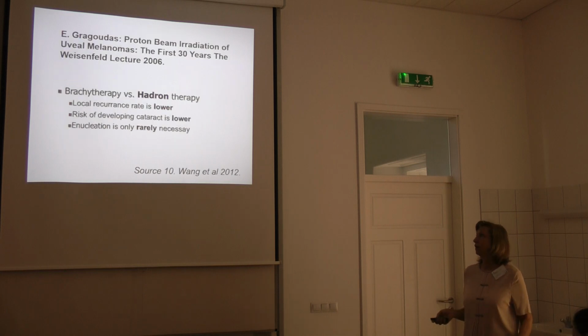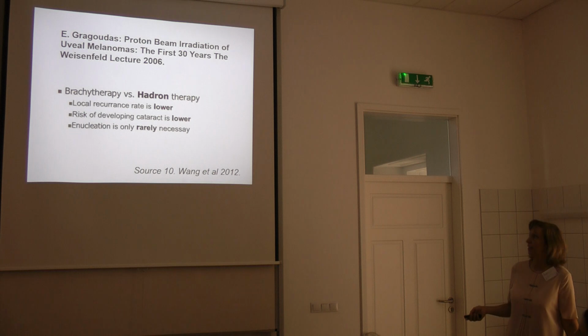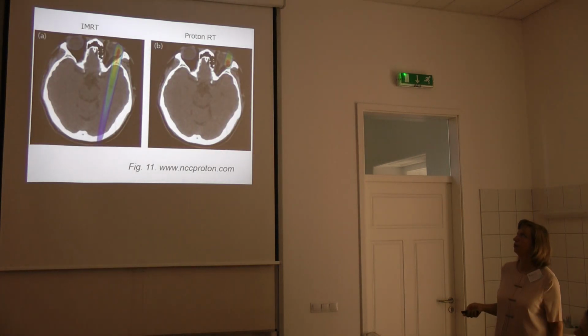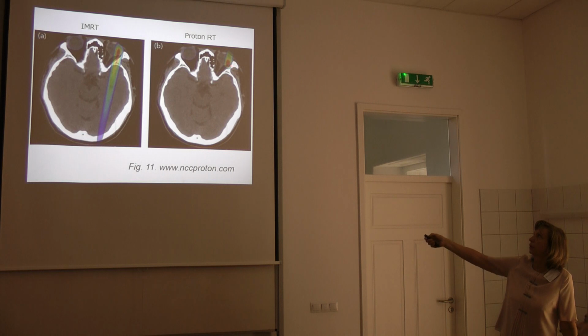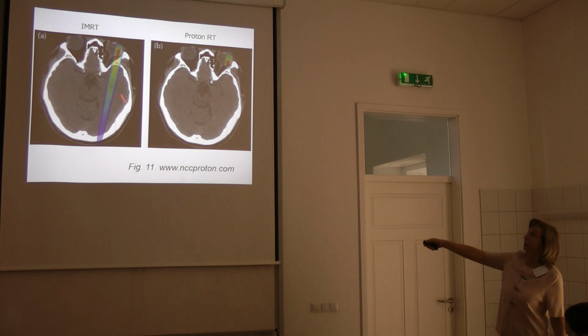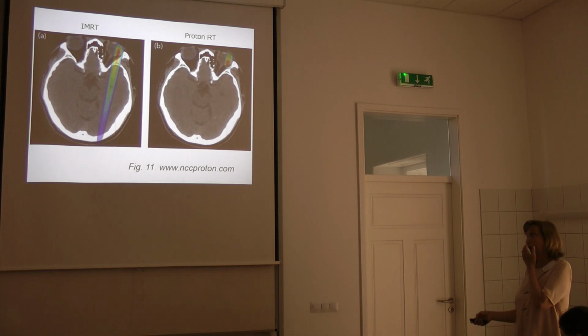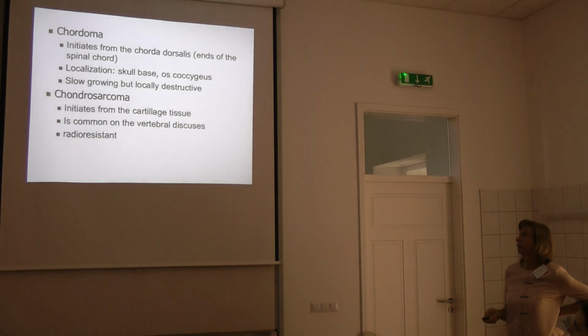And there is growing evidence of benefit from protons, so it is important to always prove the evidence at a clinical research level. And the early research showed only the calculation of difference. This is calculated proton therapy absorbing really the dose where it should be, and the IMRT, the best photon therapy, has a larger part which absorbs dose, and the CNS tumors have the same thing.